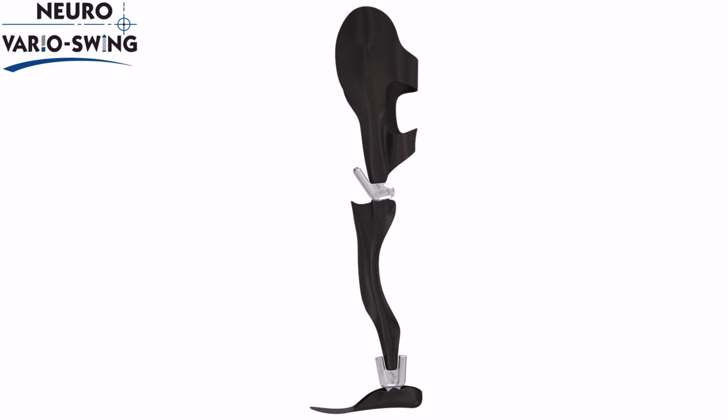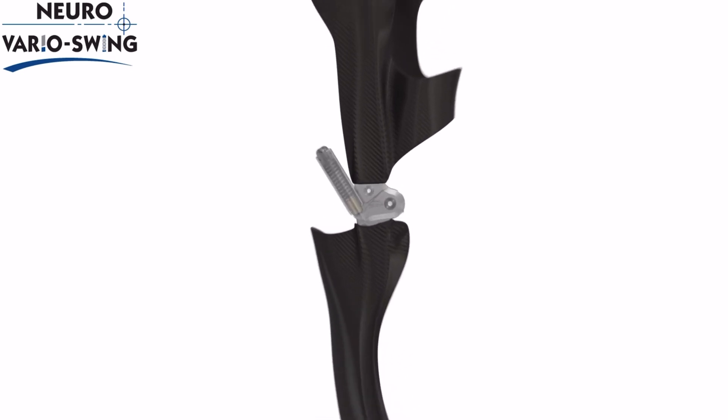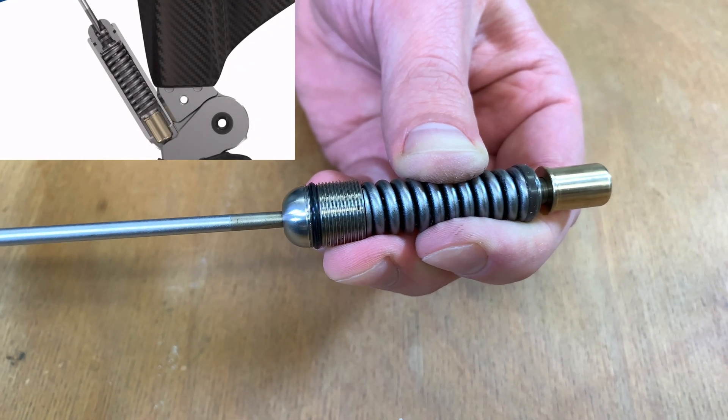Ich wünsche euch viel Spaß. In dieser Darstellung seht ihr noch einmal, was ein dynamischer Extensionsanschlag eigentlich bedeutet. Zunächst wollen wir allerdings für die ersten Arbeitsschritte der Funktionsüberprüfung den Extensionsanschlag statisch einstellen.